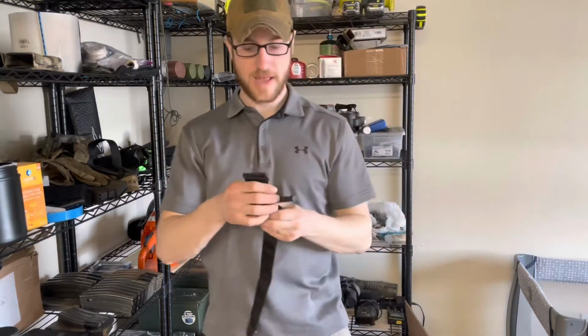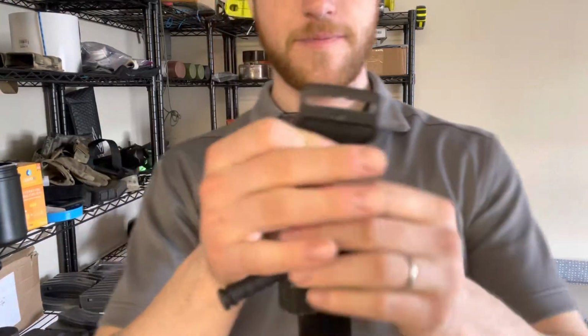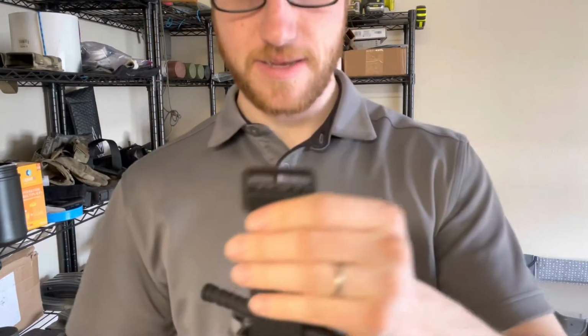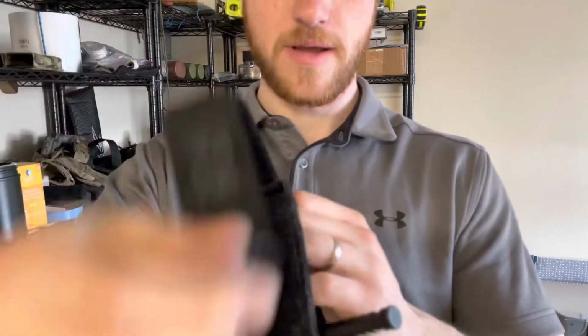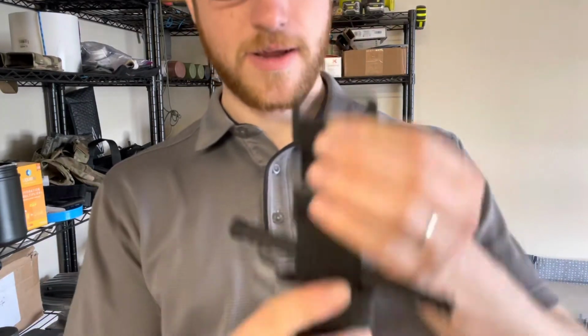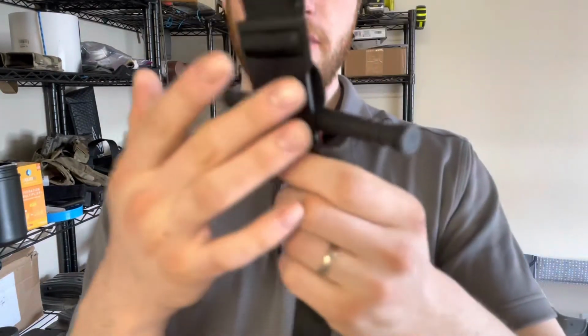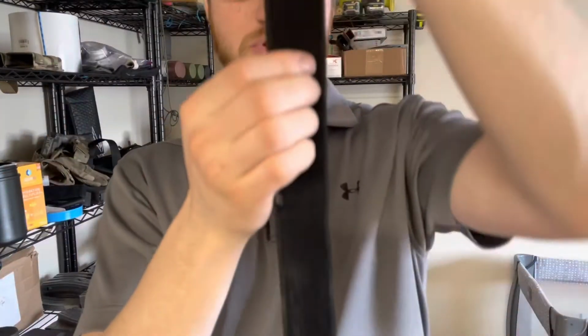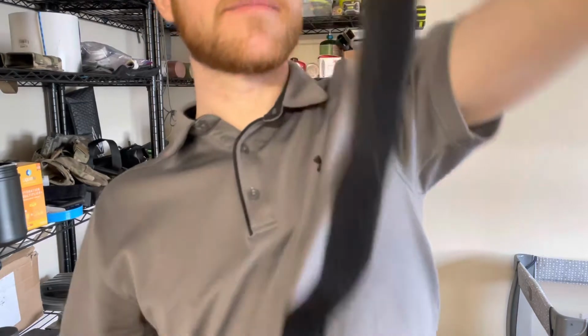Alright, so the CAT Gen 7 tourniquet has a few parts on it. So you have your friction adapter here. This is the part that you will run your tourniquet tail through and then get your band. So you have your tightening plate. You have your inner strap that runs through your windlass and then through the length of the tourniquet.